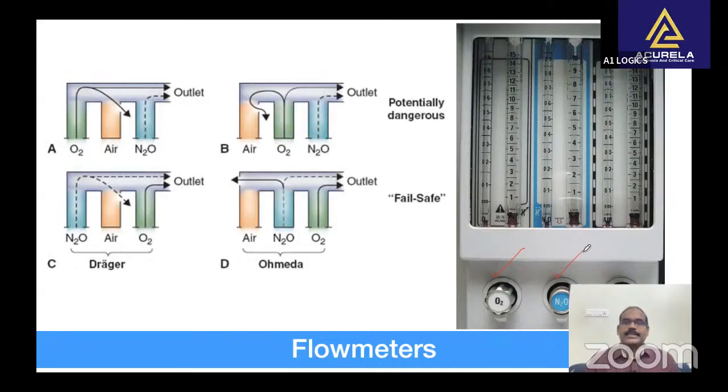The Anaesthesia Workstation standard requires that the oxygen flow meter be placed on the downstream side of the flow meter group when the workstation is viewed from the front. It is also the most downstream flow meter, closest to the common gas outlet, to make hypoxia less likely in the event of a leak in one of the other flow meters. If there is a leak in a flow meter other than oxygen, at least oxygen should be flowing directly to the common gas outlet. This is an anti-hypoxia safety feature.